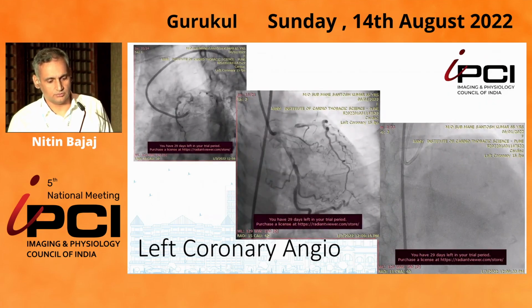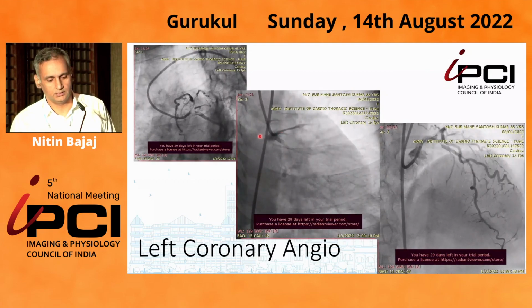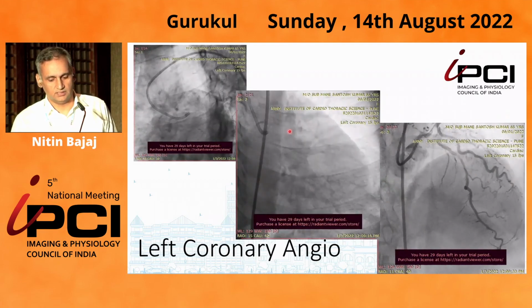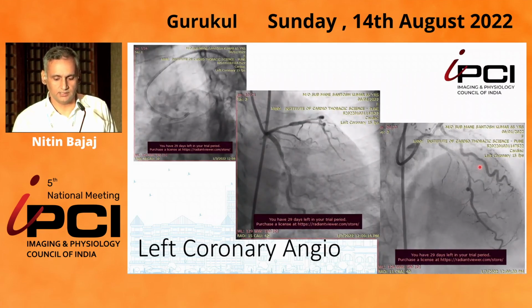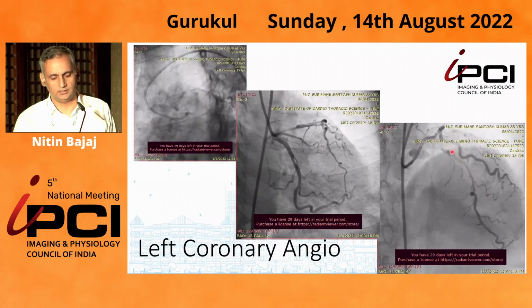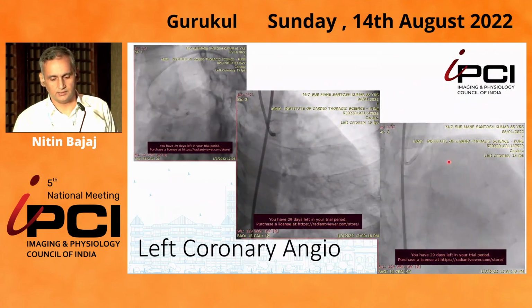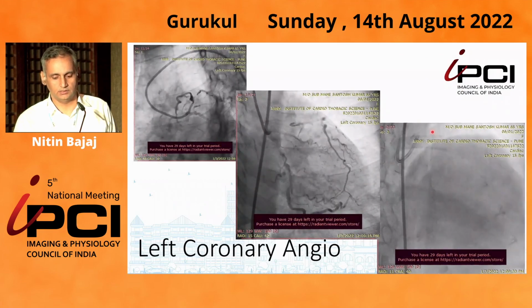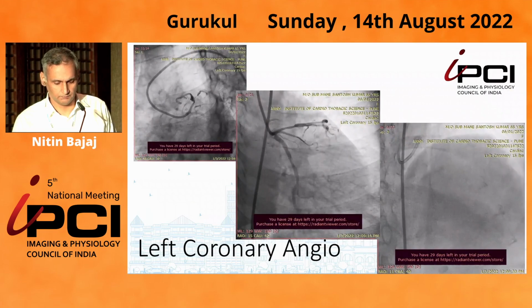So as you can see in the angiograms, the ostioproximal LAD has a long segment, about 70% lesion. Mid LAD, what I thought would be intermediate, so we went ahead with planned PCI to the ostioproximal LAD, thinking that there is a healthy segment in between these two lesions, planned to land the stent somewhere here.